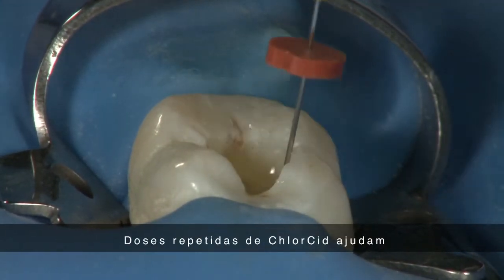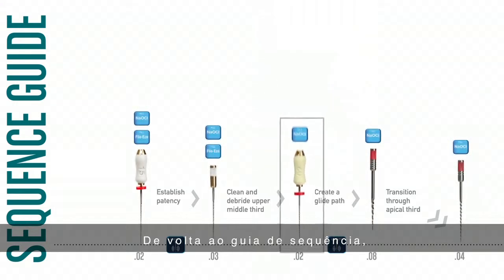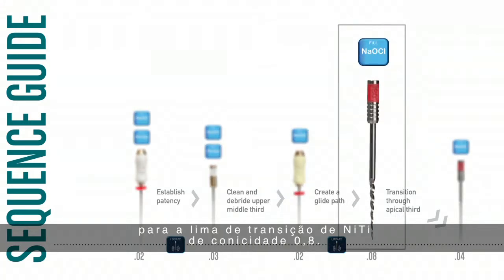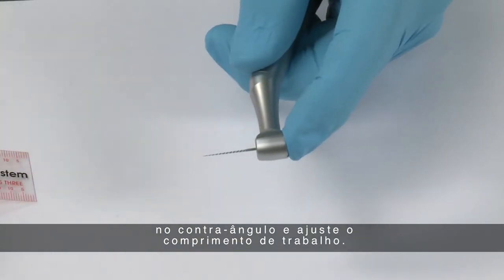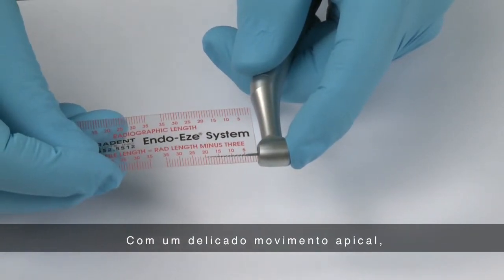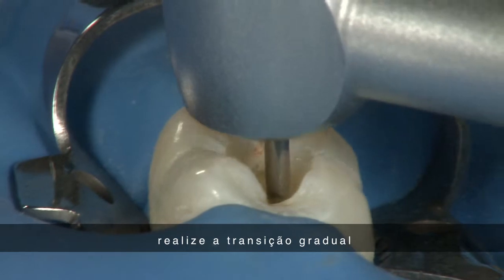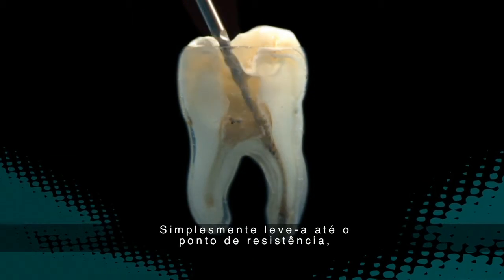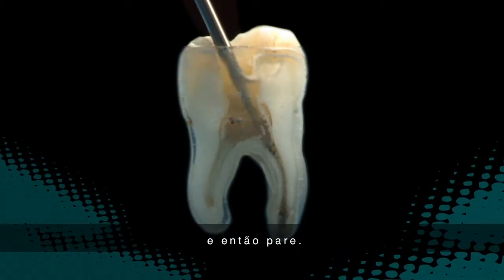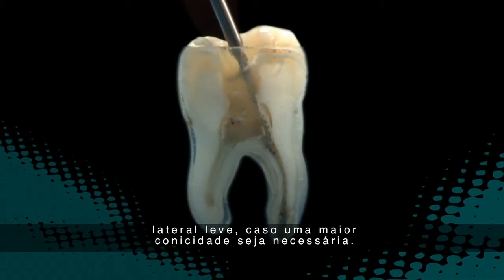Following the Sequence Guide, change from the No. 20 hand file to the 0.08 taper transitional file. Place the 0.08 taper NiTi transitional file into the contra angle and set it to working length. Use a gentle pecking crown-down motion to gradually transition the file through the apical third. It is not necessary to reach full working length with this file — simply take it to the point of resistance and stop. This file can also be used in a gentle sweeping lateral motion if greater taper is required.